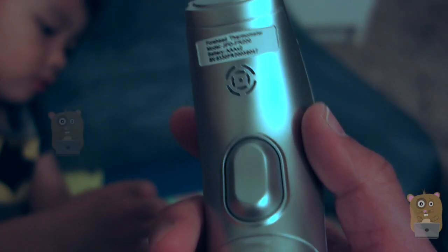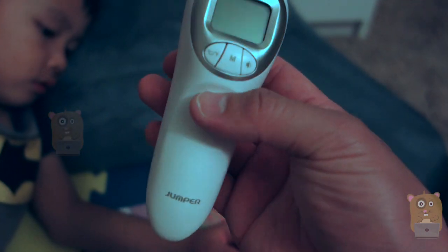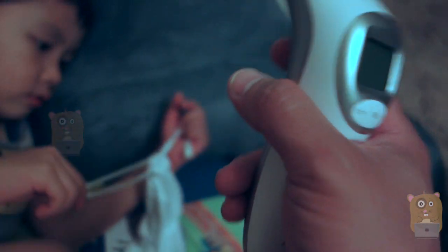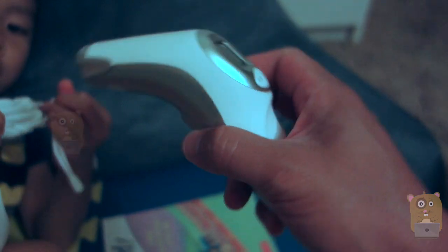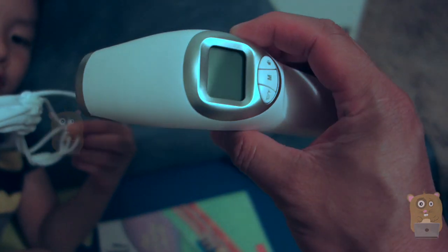This unit is very easy to use, comes with a carrying pouch, and is inexpensive. When using it, just keep in mind that you're measuring the forehead, so it's not like you're measuring under the tongue or anything. Overall, I do like this unit and I would recommend it.